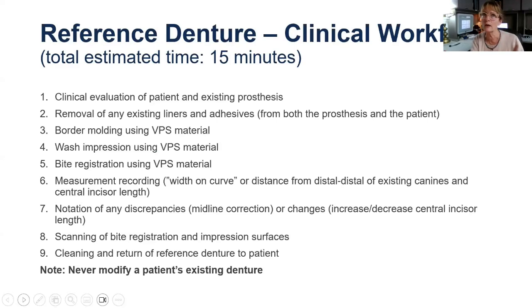So I'm going to keep going with the reference denture for just a moment. Just know that it takes a little bit of time. I would not say 15 minutes, but you do want to make certain that you apply a tray adhesive inside on the intaglio of the denture and let it dry, or air dry it, prior to taking that impression.